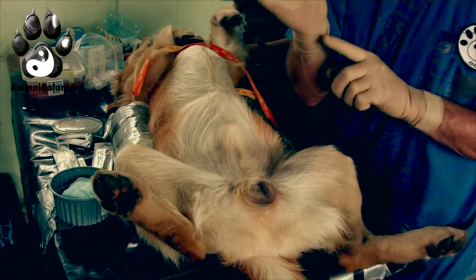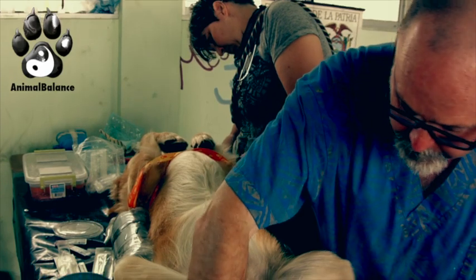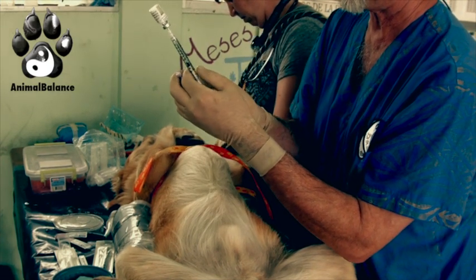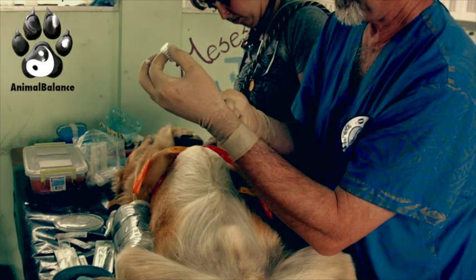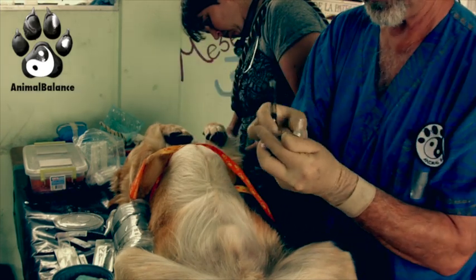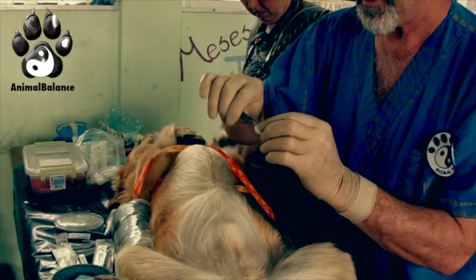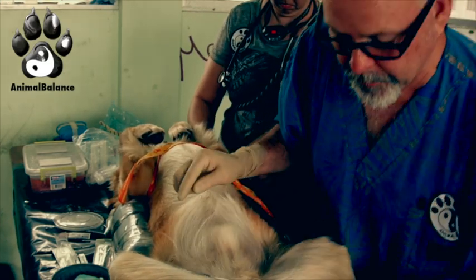We're going to use a specific 1cc syringe with a luer lock. The reason we prefer luer lock syringes is that when we draw this up and change needles, we want to make sure the needle doesn't slip off after we're done. We need to use very tiny gauge needles — I'm using a 30-gauge by 1½-inch needle.